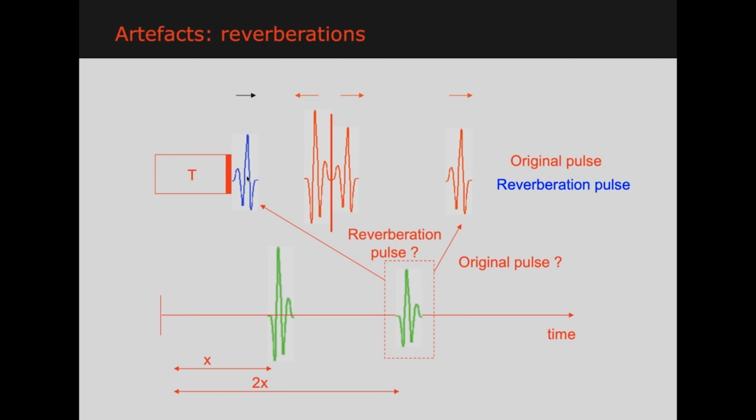So this is illustrated here. If we have this additional reflector, the first reflector will reflect back to the transducer, which then would reflect partially at the transducer surface, and then would actually reflect back in double the time here. So we get this kind of typical ghost image later on.